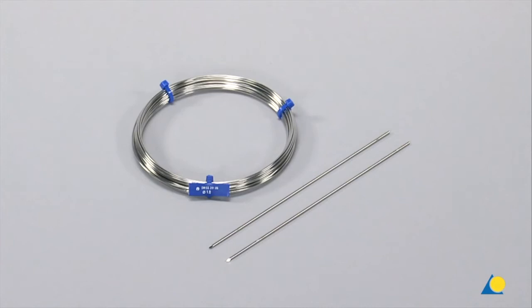The implants used are a coil of 1mm diameter circlage wire and two 1.6mm diameter K-wires.